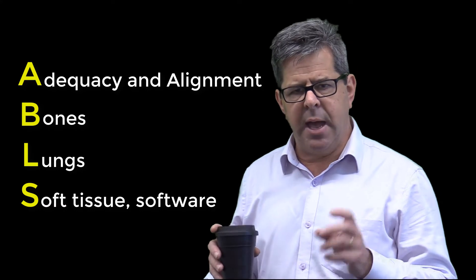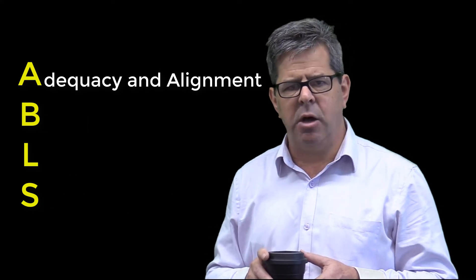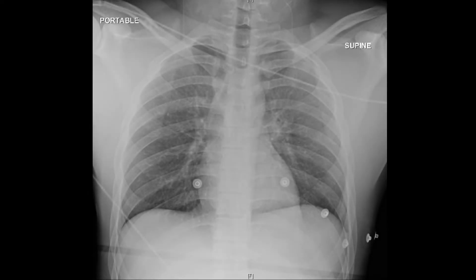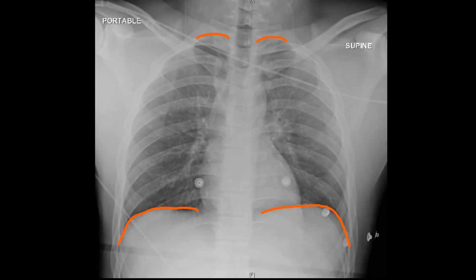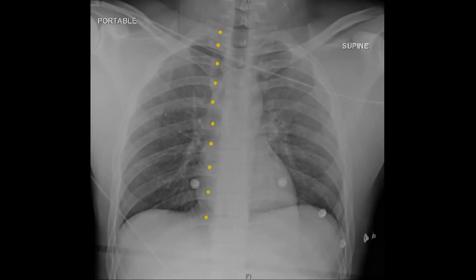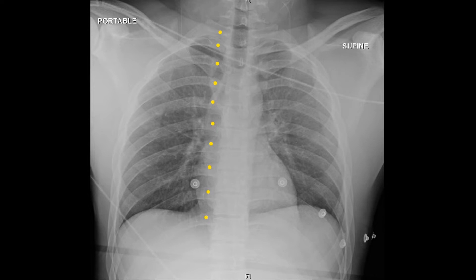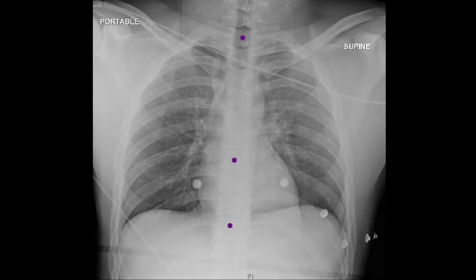Let's start with A, Adequacy and Alignment. Is this film adequate? Is it rotated? Look at the clavicular heads — are they equidistant from the midline? Can you see all the lungs from the apices to the costophrenic angles? On a good inspiration, you should see 10 ribs. Poor inspiration is common with trauma and will make the lungs appear more radio-opaque. Is it properly penetrated? The vertebral bodies should be well seen around the neck, just seen behind the heart, and not seen through the diaphragm.